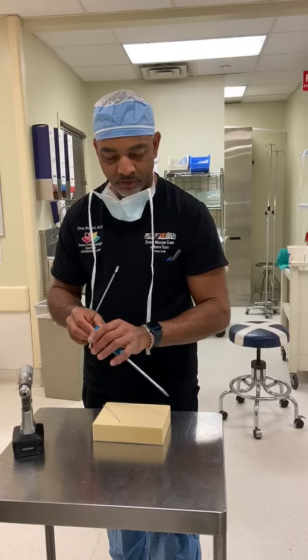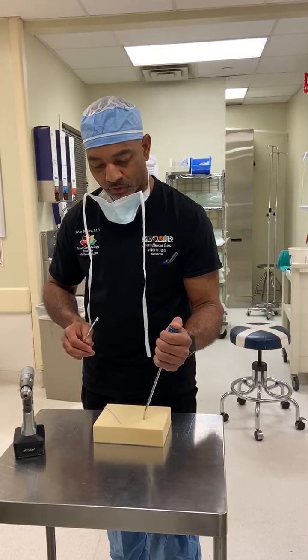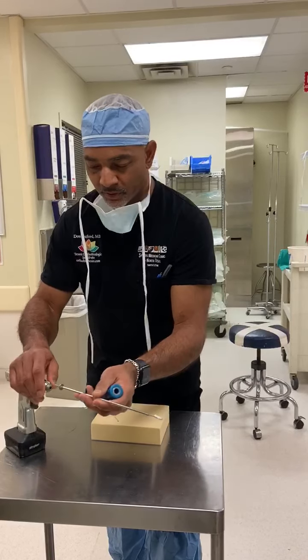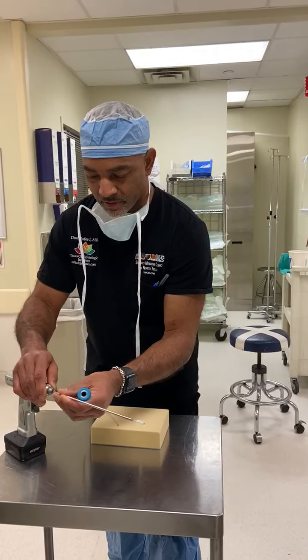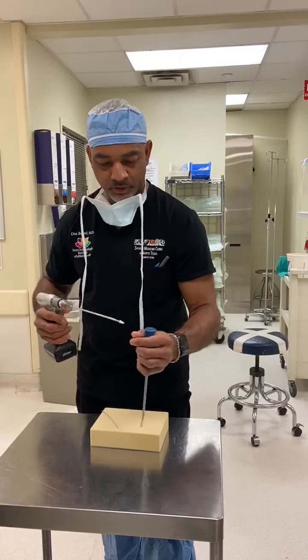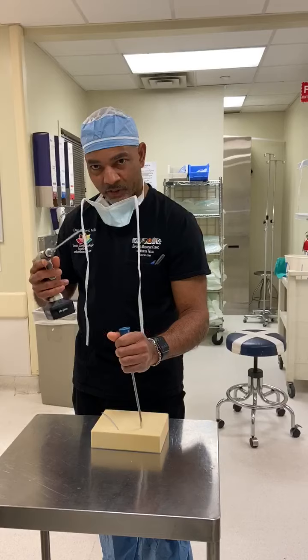And here's the cool part — here's the guide. Most of the surgeons watching this are familiar with having a guide for a drill. This just pops into the drill. Here we go. Spin it. It works. Here's the guide — notice the anchor is on the drill.